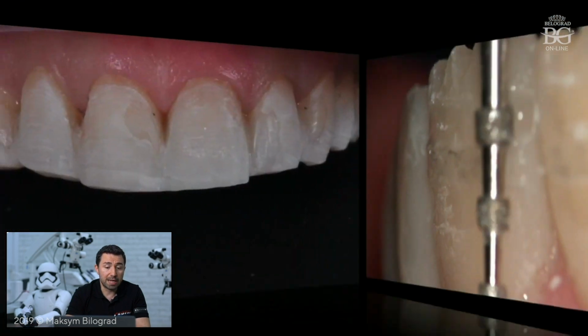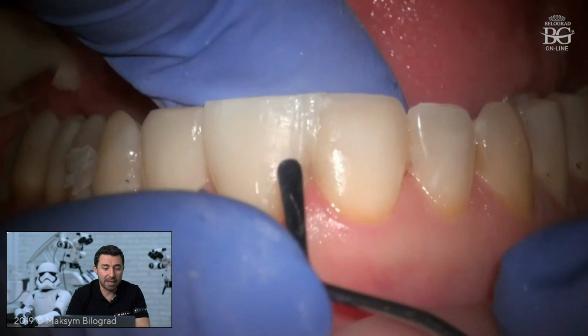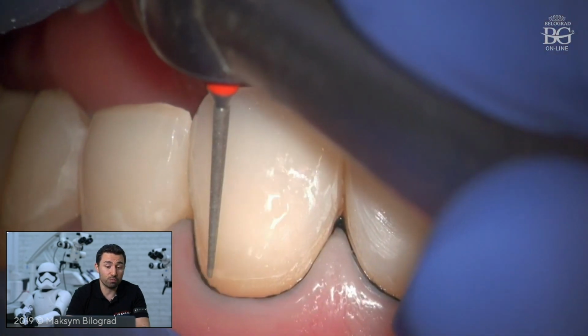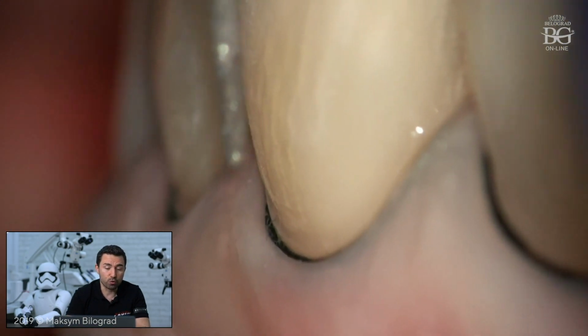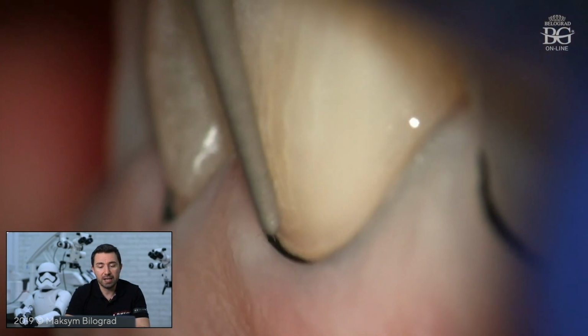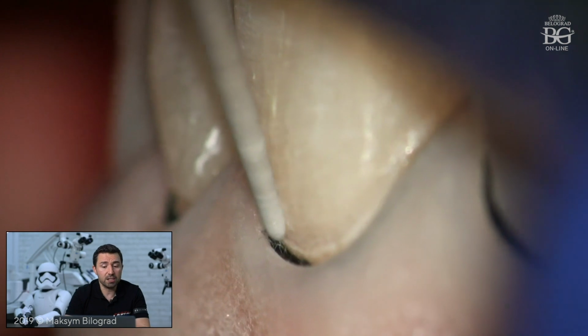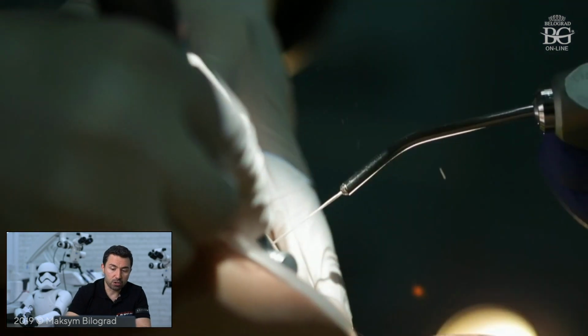And you will see later on, once I finished my step 1 preparation through the mock-up and then removed the mock-up, you can see that teeth were not touched. So, prepless preparations. We made finish lines. We prefer to do finish lines because it is easier to fabricate veneers, easier to isolate the case, to bond veneers, and to polish the transition between veneer and tooth. That's why we do this finish line.